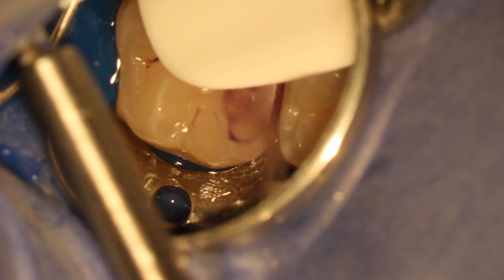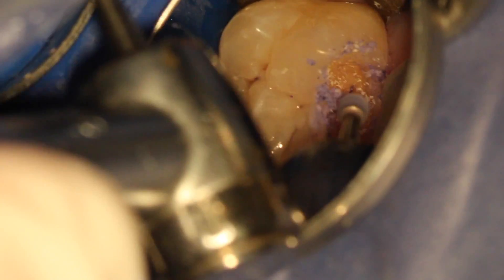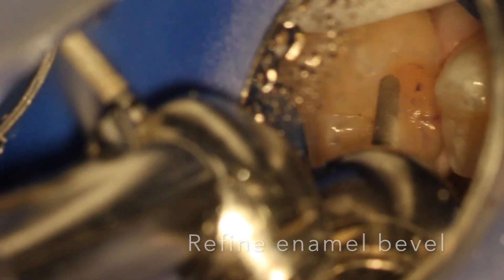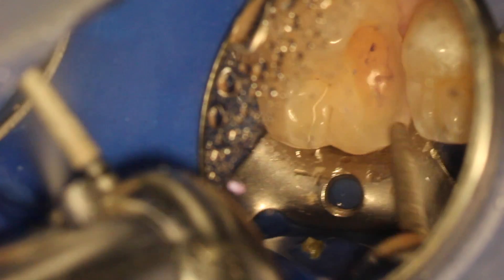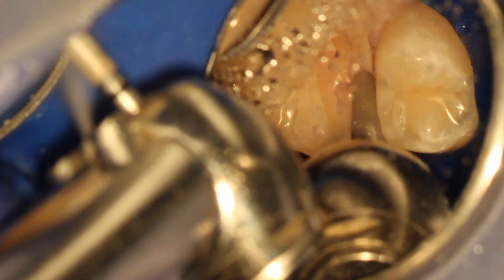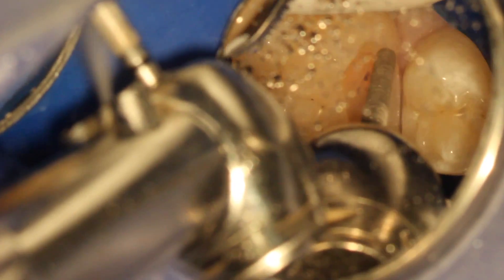I had a good margin of enamel around the prep and no pulp exposure, so despite repeated steps, everything looked pretty good. Used the high speed diamond to refine the bevel circumferentially to get a good margin. Everything was super gingival, so no need for crown lengthening or anything different.